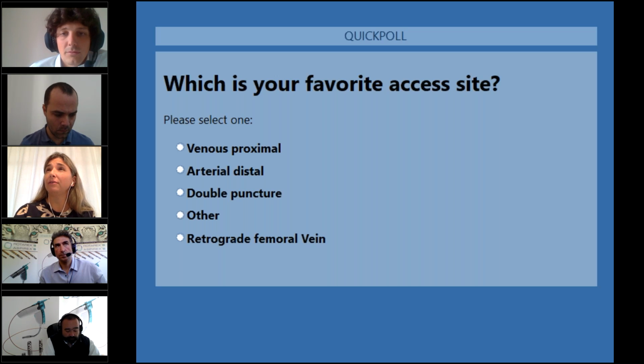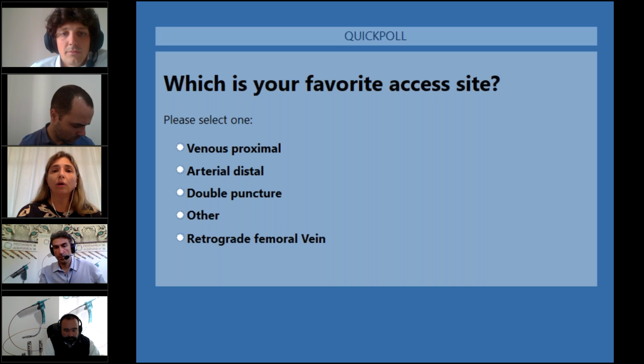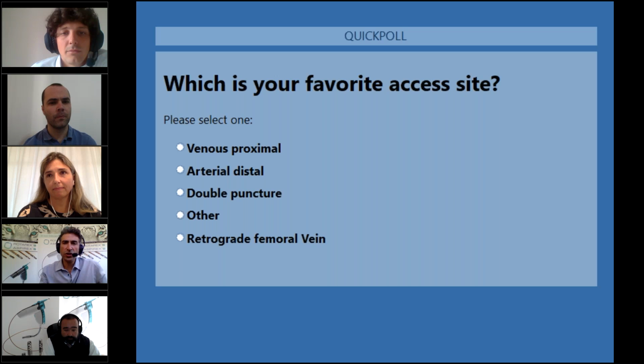When I use the femoral vein, the two drawbacks are that I have to use a long sheath for support, and if I use an 8 French system, I'm going to have a little difficulty finding that long sheath. And the other problem about the femoral access is that you work retrograde. So if you have a complete occlusion, sometimes it's a little more difficult to go through it. But it's a good access. And would you go in that case for the double puncture? Yes, I usually for occluded AV fistulas or grafts go for the double puncture, venous puncture.